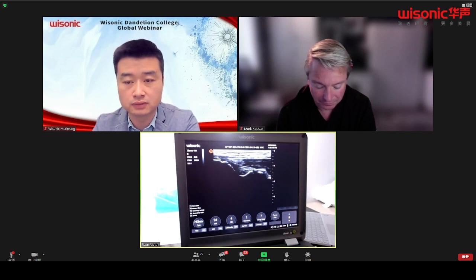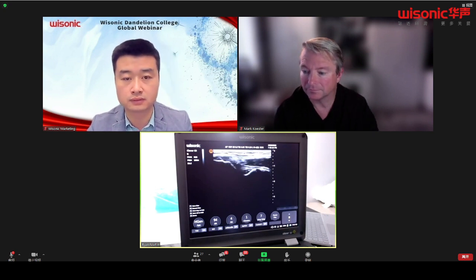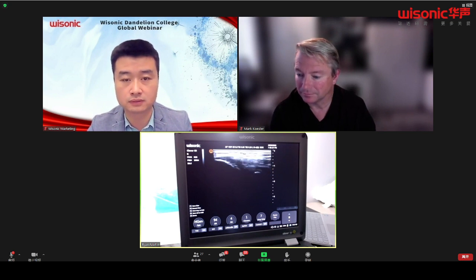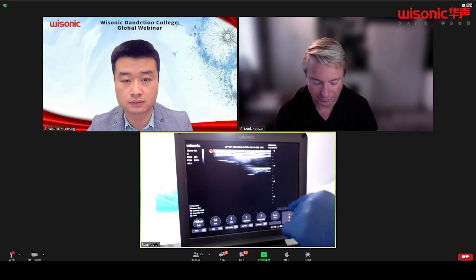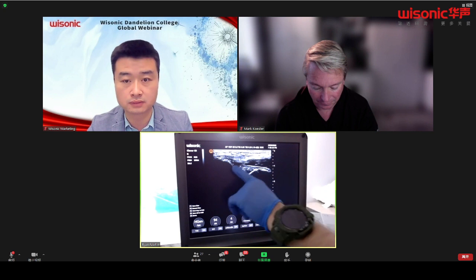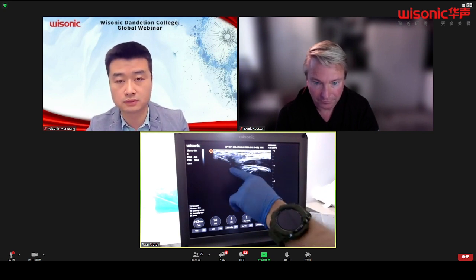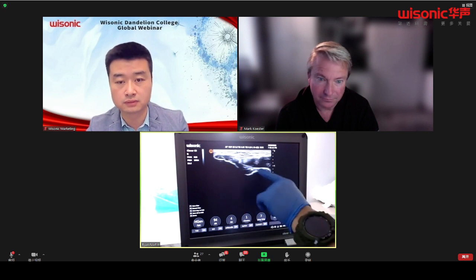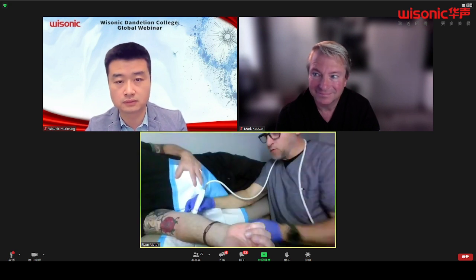And we're going to test for mobility. And it moves a little bit. Okay. So we do have some pre-existing pathology here. It's always not fun for him, but it's always fun for us to see not only the normal, but also the abnormal. Now I'm working on to the common flexor, which is what we're going to look at next. But remembering that UCL is that little triangular shape that comes from that downward ridge down to the sublime tubercle at the joint line.